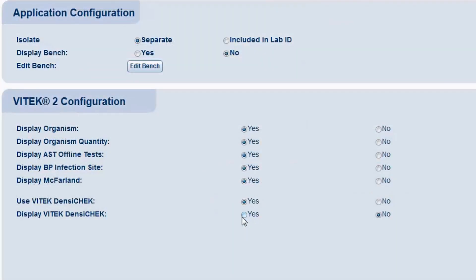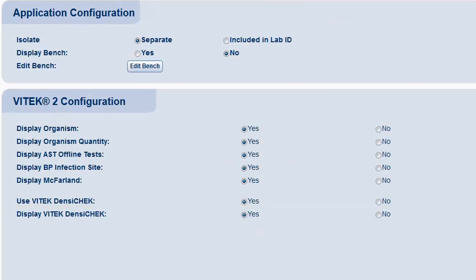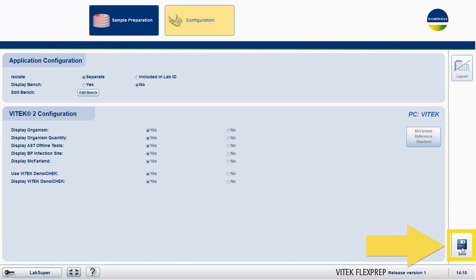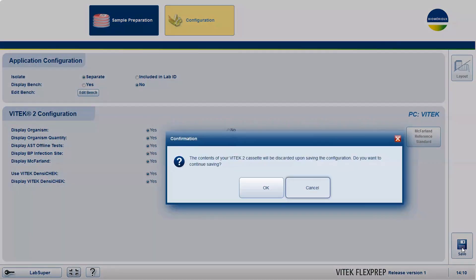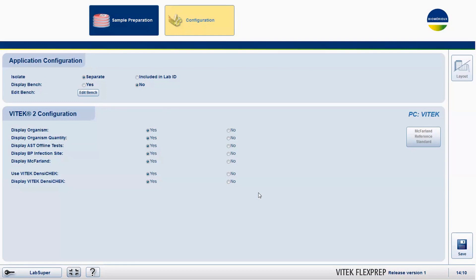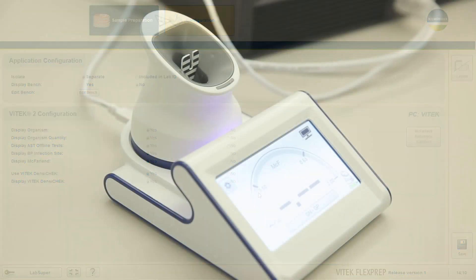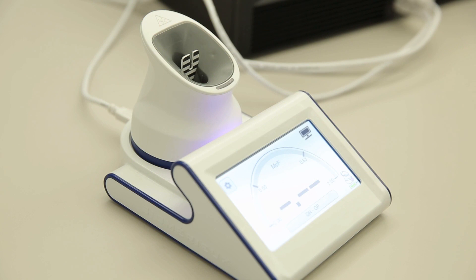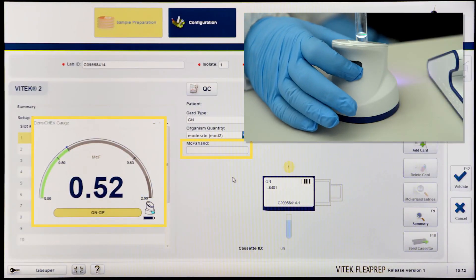On the Configuration page, select Yes for Display Vitek Densichek to display the McFarland meter in the software if desired. Click the Save button. Click OK. Close and reopen FlexPrep to refresh the settings. Once the Densichek has been connected to the Vitek 2 PC, the communication bridge has been installed, and the Densichek certificates configured in FlexPrep, the Vitek Densichek is ready to use with FlexPrep integration.